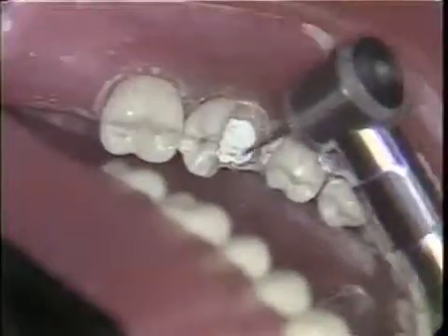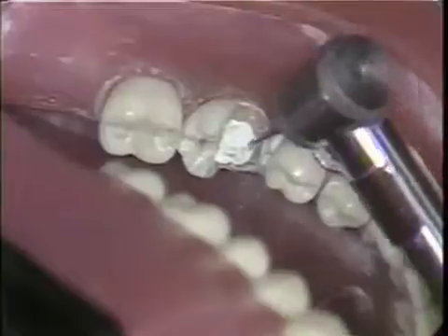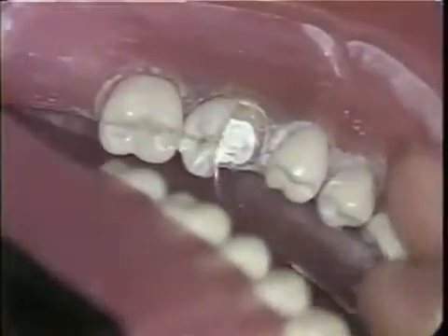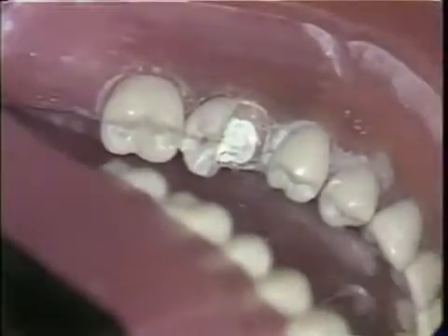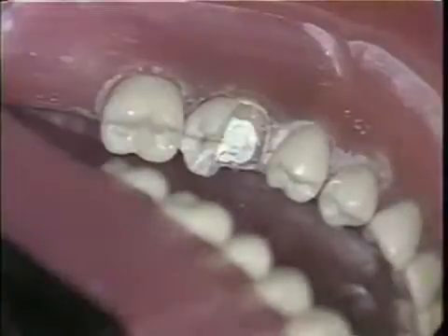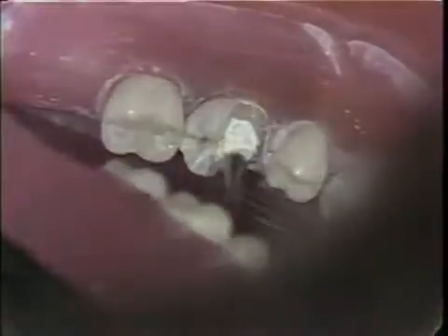Retentive areas are now placed into the remaining sound tooth tissue for retention of the zinc phosphate cement. A half-round burr is used to do this. Inlay consistency zinc phosphate cement is placed in the retentive areas, then cement-base consistency zinc phosphate cement is placed over the pulpal floor of the tooth and any other necessary areas. Amalgam pluggers are useful in smoothing the cement.